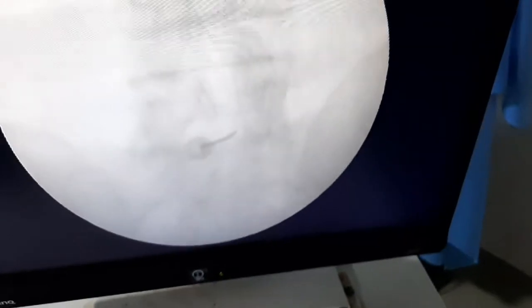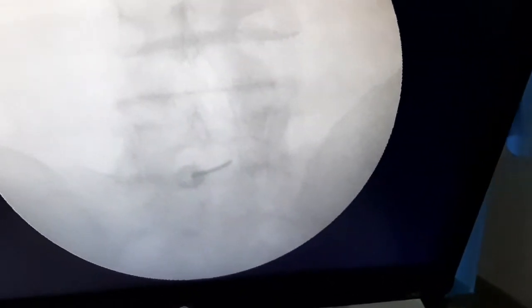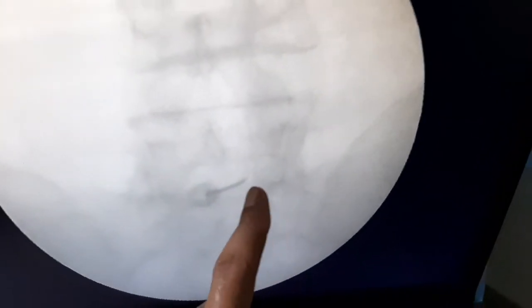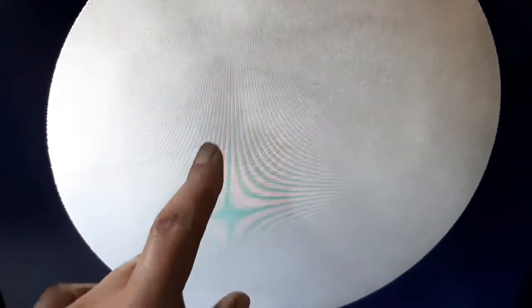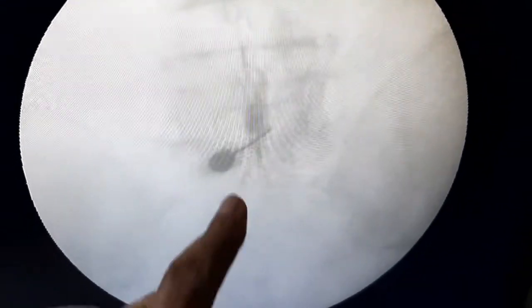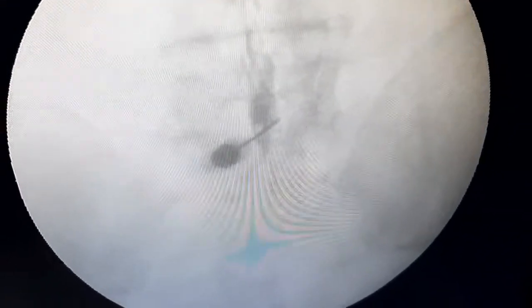I used a steroid with local anesthetic and antibiotic combination. After that, I performed a targeted epidural — also targeting the L5-S1 root. You are seeing the needle, and in the lateral view you can see the dye spread in the epidural space.